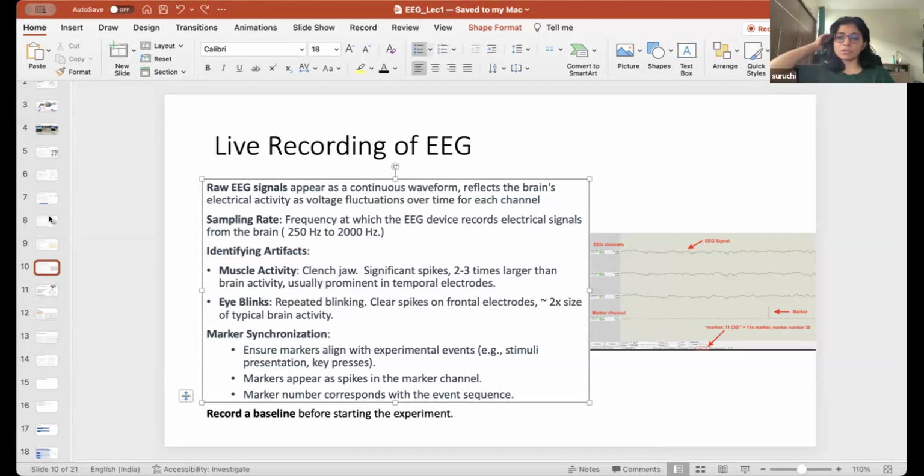Where are the temporal electrodes? Here, near the ears. Yeah. So that, and then eye blink, you already know. You ask them to blink their eyes, and you see it almost like a large V shape, or inverted V shape. If it's not working, it will be like a straight line, right? Yeah, it will be either straight or noisy or whatever, right?